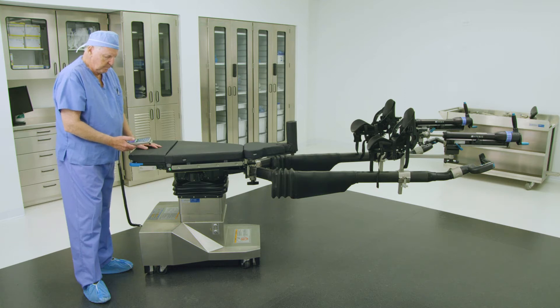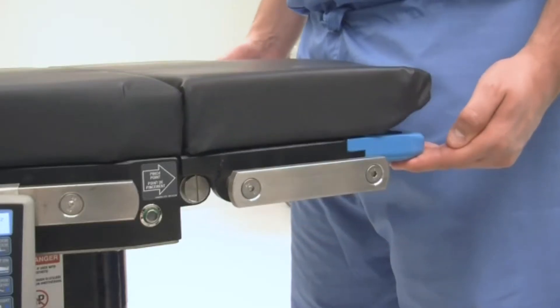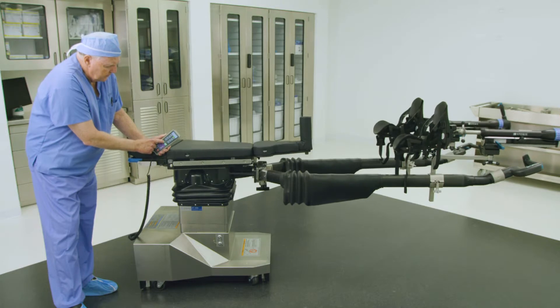The tabletop must be leveled before manual unlatch buttons are available for use. First, ensure the head section is level and manually adjust as needed. Next, press the level tilt button on the hand control to ensure that the tabletop is level.